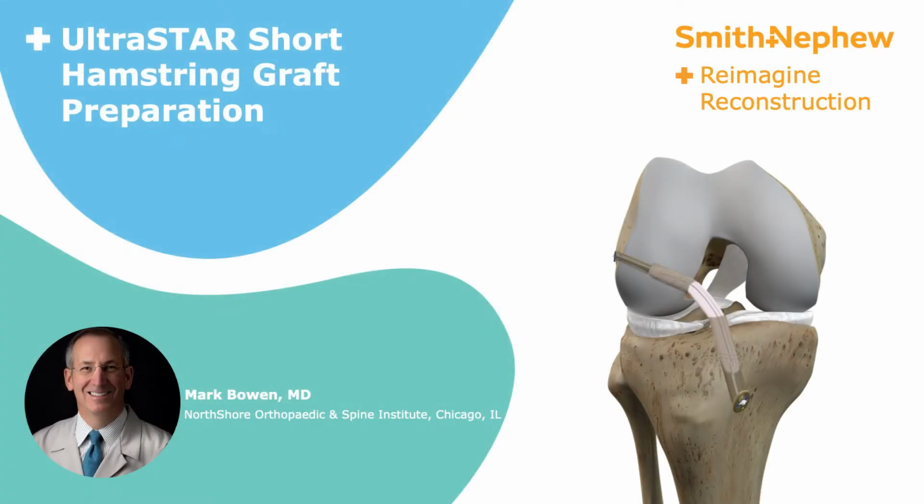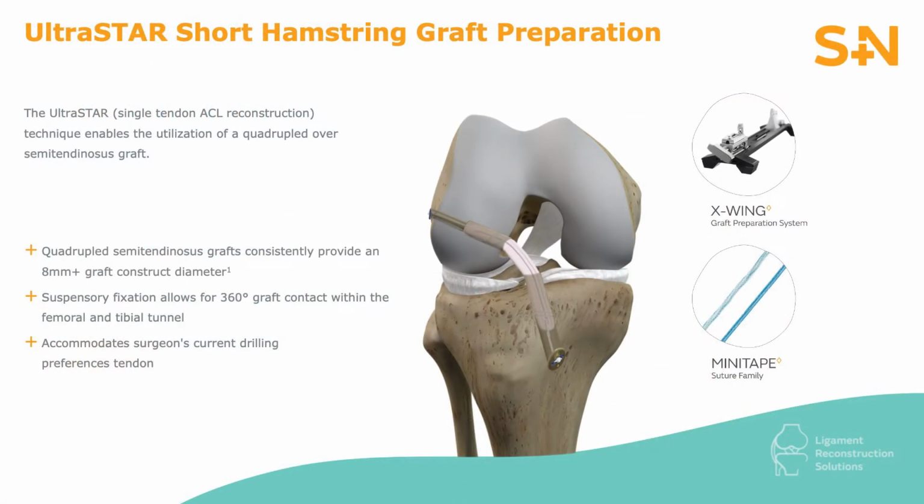My name is Mark Bowen. I'm an orthopedic surgeon specializing in sports medicine. This video is to demonstrate an alternative technique for situations where the tendon harvest is shorter than ideal.